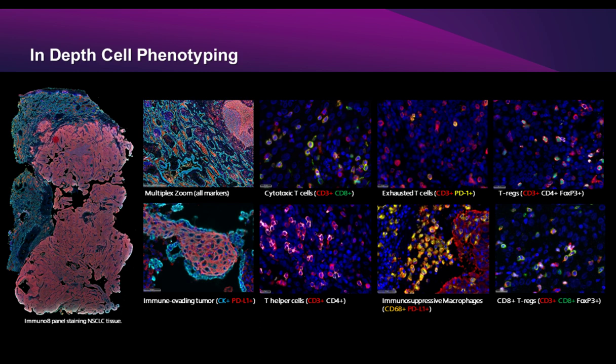That's what makes the optimization quite difficult, and it can skew what you're observing from a biological perspective. You're basically turning a low expressor into a brighter expressor, and a high expressor into more of a medium expressor, just to be able to unmix the image.